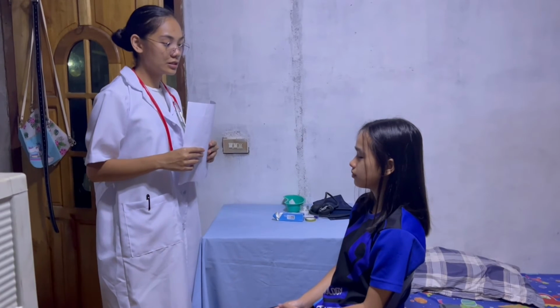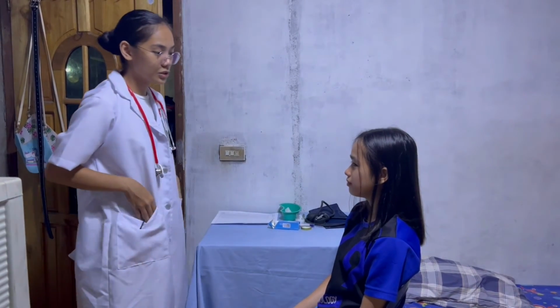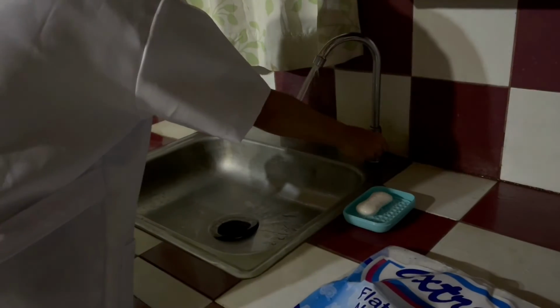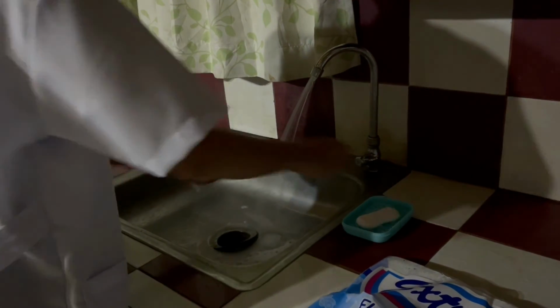Before performing the procedure, you must first introduce yourself and verify the client's identity. Explain to the client what you are going to do and why it is necessary and how she or he can participate. Hello ma'am, I am Zara May Deliza and I am the nurse assigned to you. May I know your name? Karen Delizo. Thank you. Today I will be checking your blood pressure. Would that be okay with you? Yes.